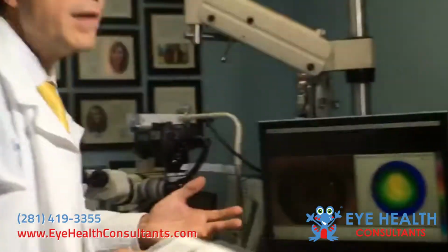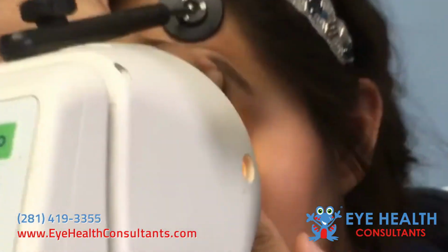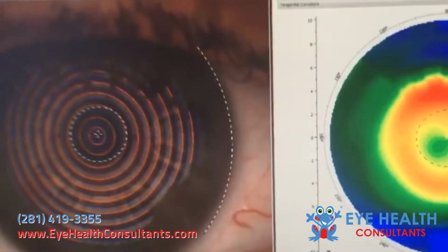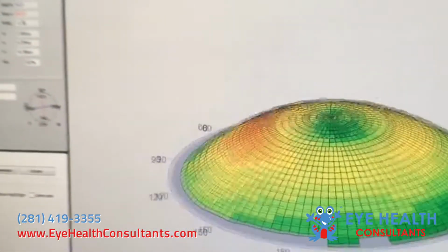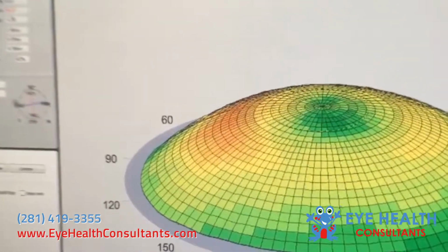There are different types of corneal topographies. We've had 3 different ones over time. We like the portable type because it's obviously more convenient for the patient. All right. So what we're doing now is to capture 15,000 points of data from the corneal surface of the eye. What we're seeing is that we're flattening the central part of the cornea. This is a myope patient or nearsighted individual that needed a modification of the corneal shape in such a fashion that the central portion is actually flatter.